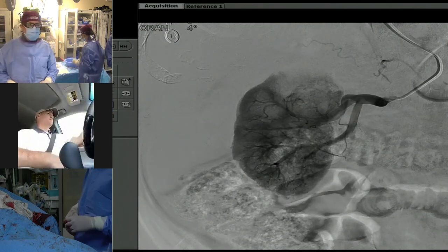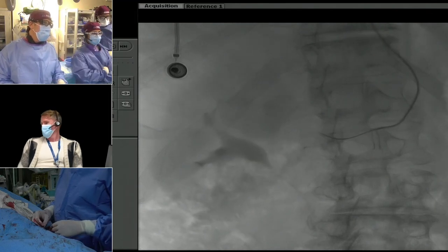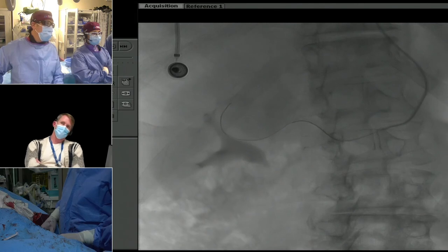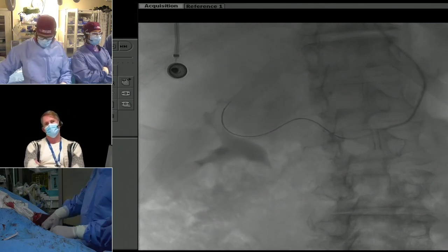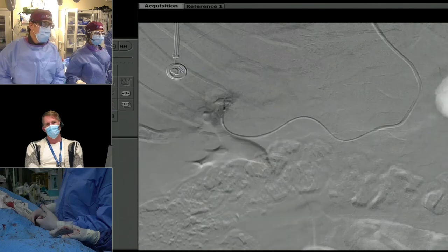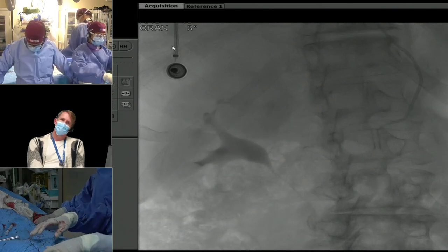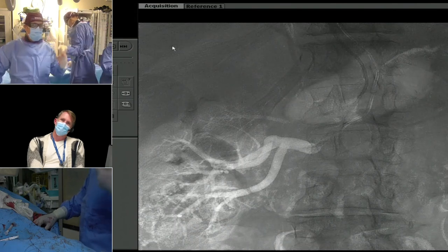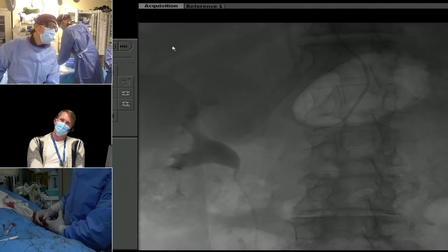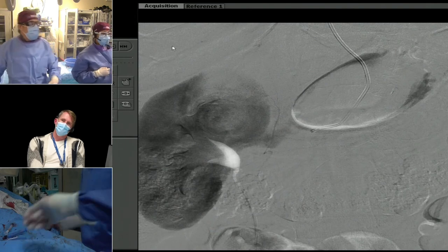Okay, let me see that wire. Check. I would expect to see a little bit more hypervascularity on this angio, but you see the tumor there. It's sitting there waiting for us. You think that's it? That looks like it's pointing to it, could it be it? Let's just go up here and take a look. Nope. Everything but, right? We're going to take a different oblique here just to make sure that we actually see. We're not going to pull back into the aorta this time. It's just really not that.